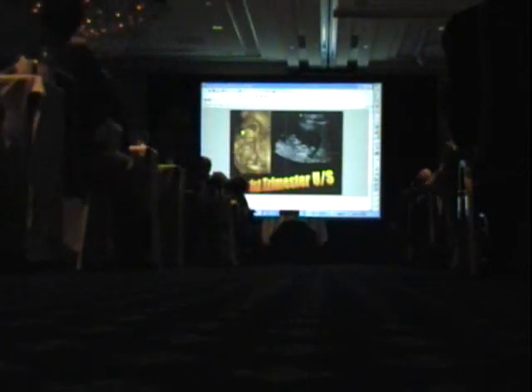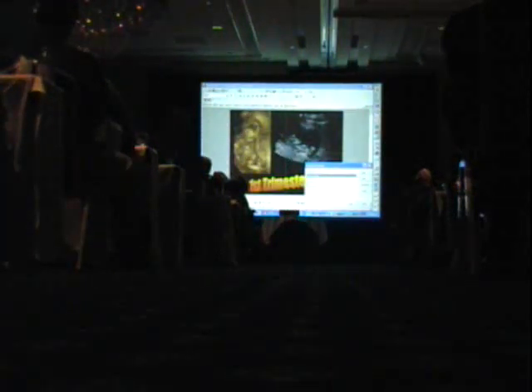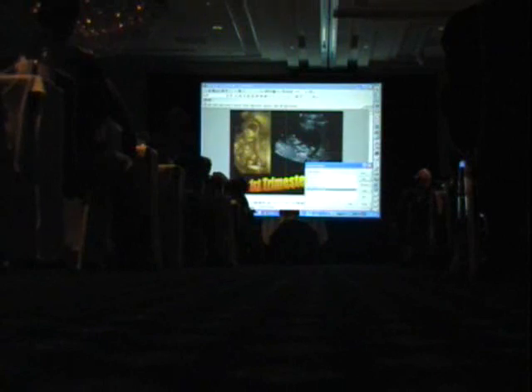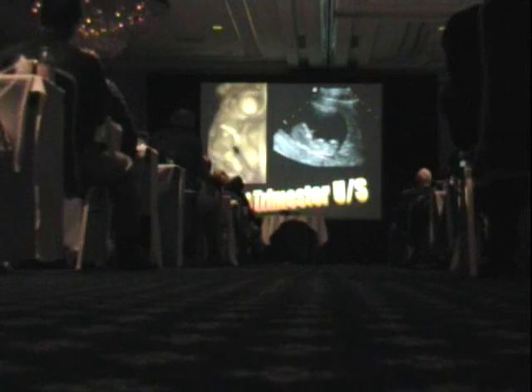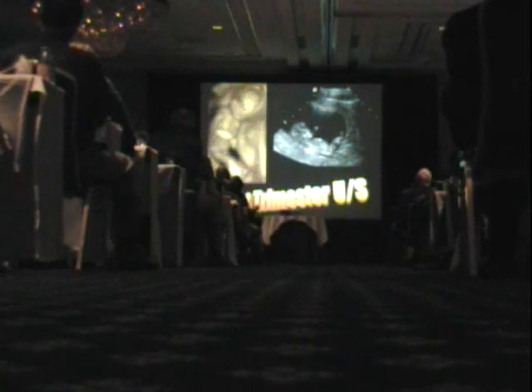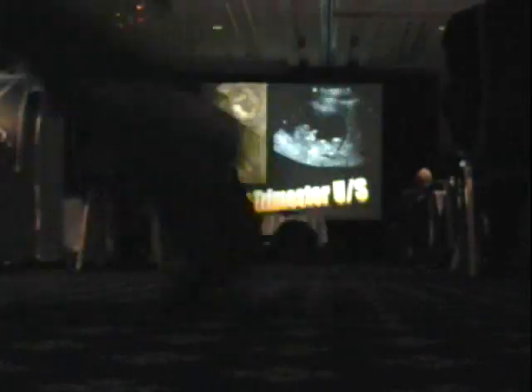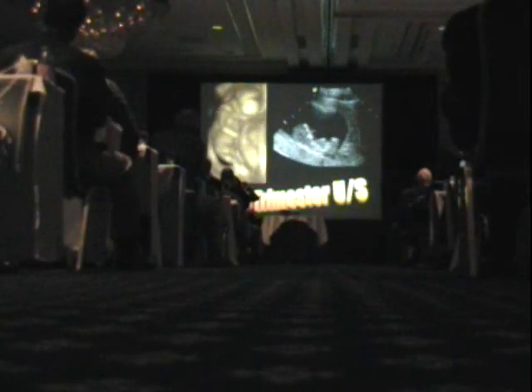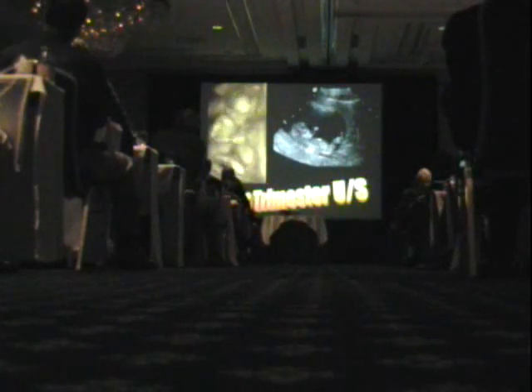So let me switch rapidly to the second talk that I have to give here, which is on the first trimester. Ultrasound in the first trimester has become much more productive and also much cooler these days that we have nice three-dimensional pictures.